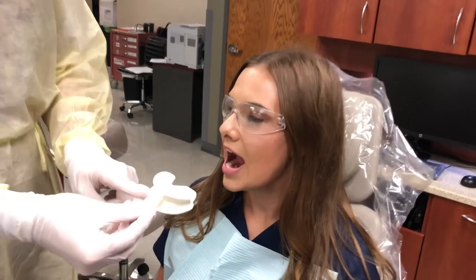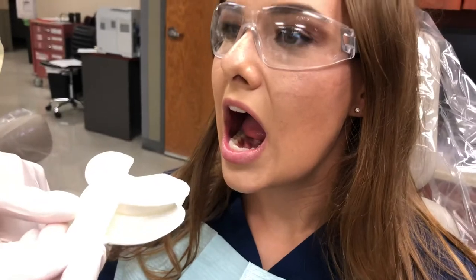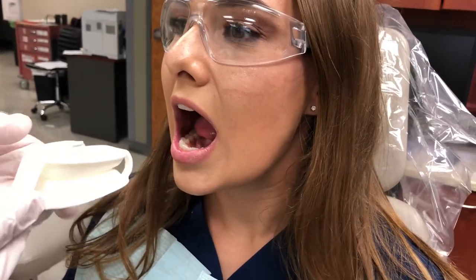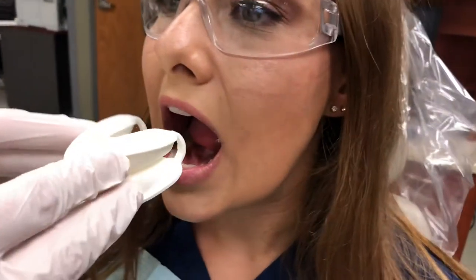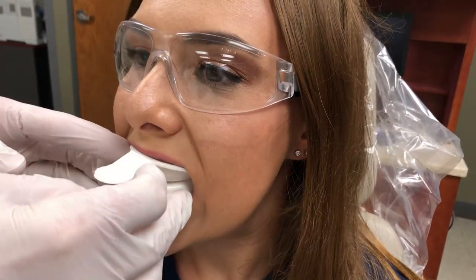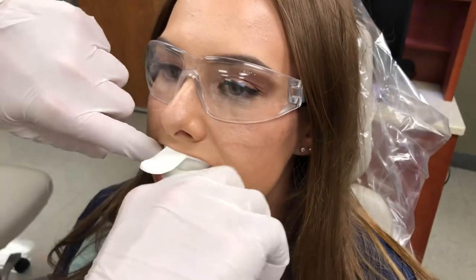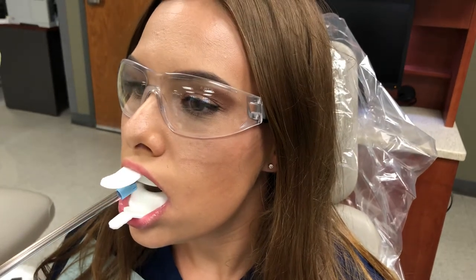You will insert the fluoride trays into the patient's mouth and then place the saliva ejector between the fluoride trays throughout the procedure. We do not have product in here, but this is showing how to place inside the mouth. The U tray is for the upper — you're going to squeeze it, put it in, have her tap down, and then bring her lips around. Then place the saliva ejector inside, and with the saliva ejector turned on, they would stay this way for four minutes.